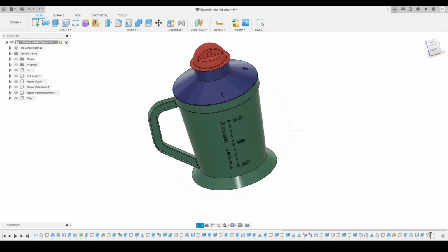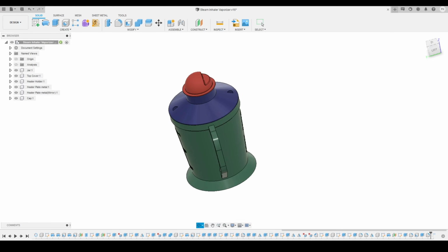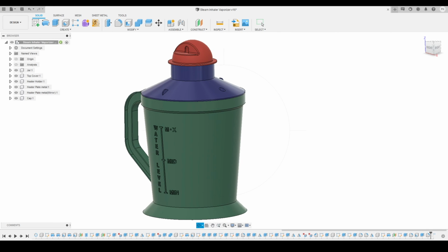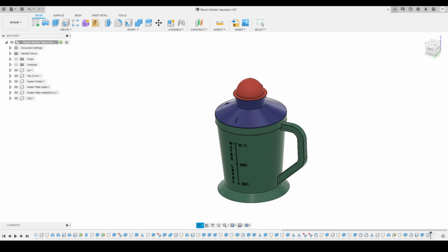Model this steam inhaler vaporizer inside Autodesk Fusion 360. This is a complete playlist where I'm going to cover this complete steam inhaler vaporizer 3D modeling inside Fusion 360, and there will be multiple videos in this complete playlist. I will start with the first part, where I will start modeling the jar.